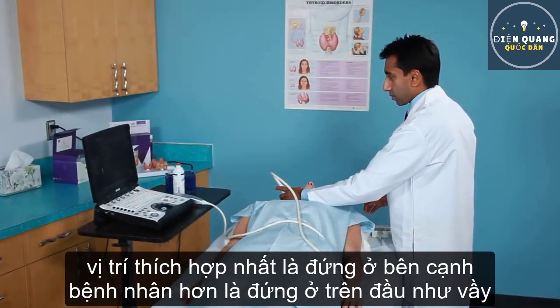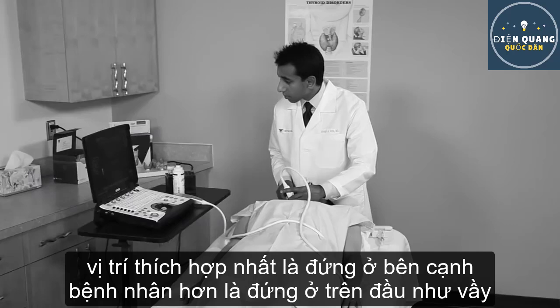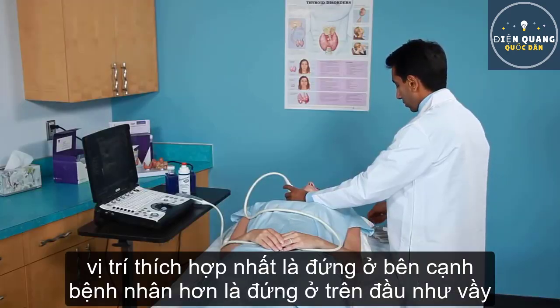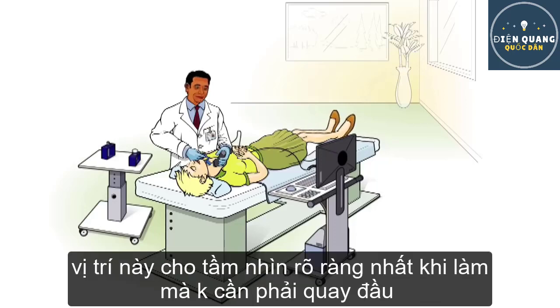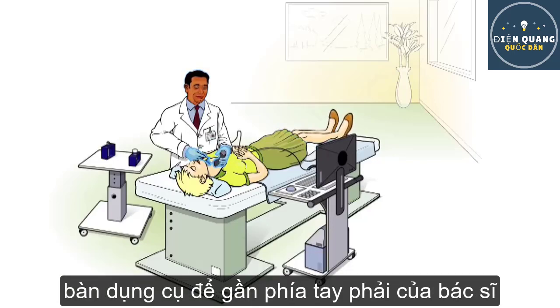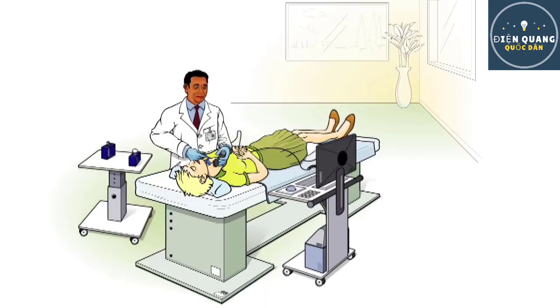It is preferable to stand to the patient's side rather than at the patient's head. The ultrasound machine can then be placed across from you. This position allows visualization of the ultrasound screen directly without turning your head, and allows your hand movements to directly follow what is on the screen. The ultrasound machine has wheels and should be moved to the proper position.